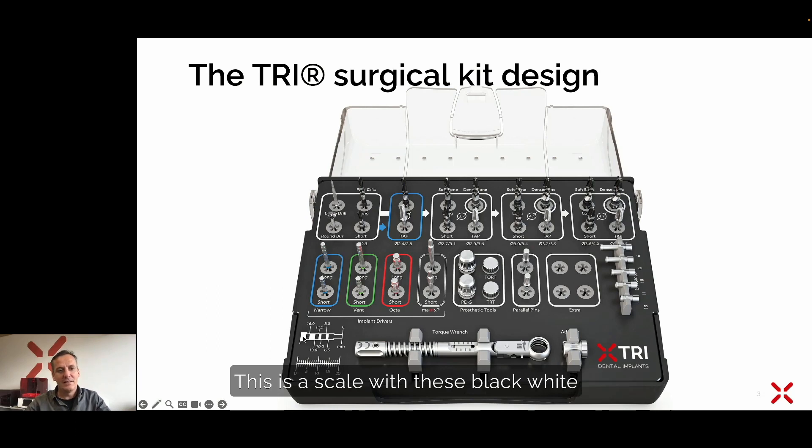We have some more helpful tools to show. This is a scale with black and white marks, which can help you to control if you have the right depth for your implant. You can see our implant lengths: 6, 8, 10, 11, 13, and 16 millimeter. Below that, there is a millimeter scale where you can verify at the last moment if your implant has the right length. We also have a torque control and an adapter here to adapt each of these ISO-normed drills to this adapter and to your torque wrench.